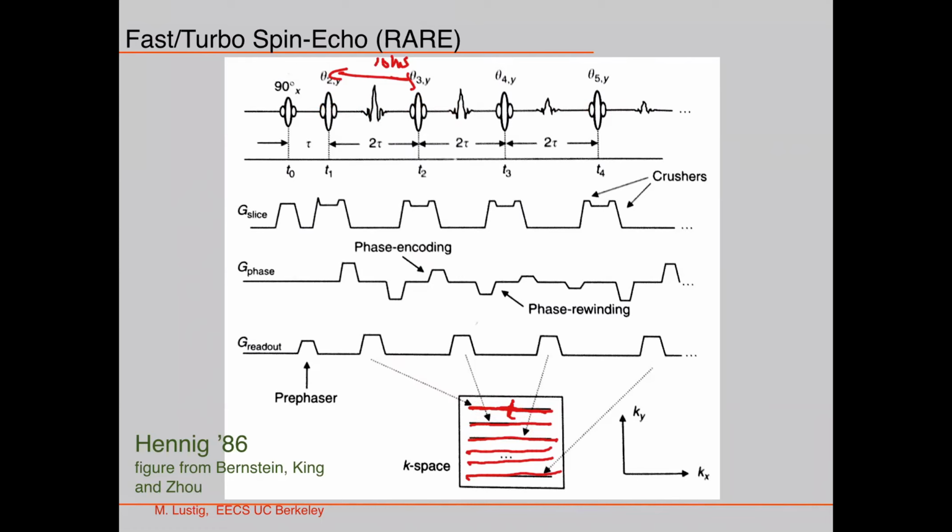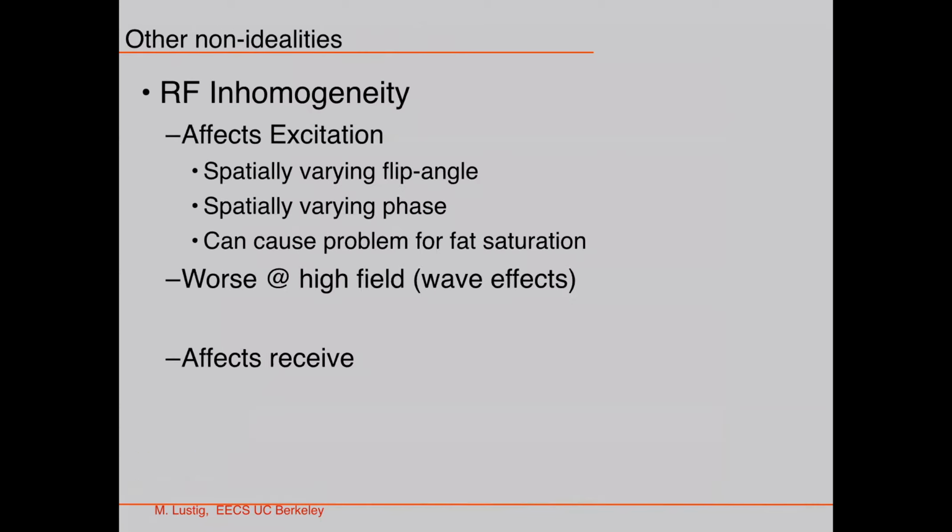I have to think about it. Because the same magnetization refocuses again, and so now you can encode it again because it's going to appear. So I can do another gradient echo, and then it appears again, and so I can encode it again, and so on and so forth. But I can encode it with different phasing codes. And if I do that, then I create an image. By the way, that can be a fantastic project implementing that, for example, on the aspect scanner.